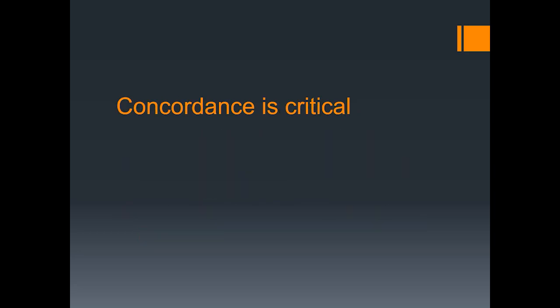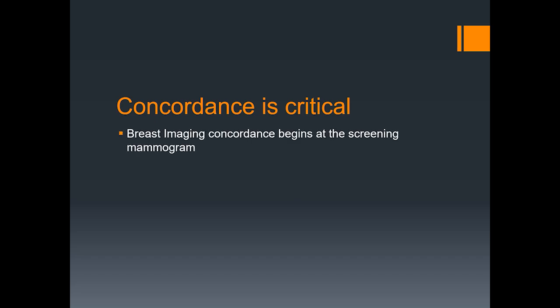Concordance is critical, and this is the thing that we'll see throughout this lecture. It's very important to understand that our decision-making doesn't end when our biopsy is completed. It begins at the screening mammogram. What do we see when we're considering a callback or a BI-RADS 0? What do we see in a single view? What do we see in 2 views? What do we see on the digital mammography and possibly the 3D imaging?